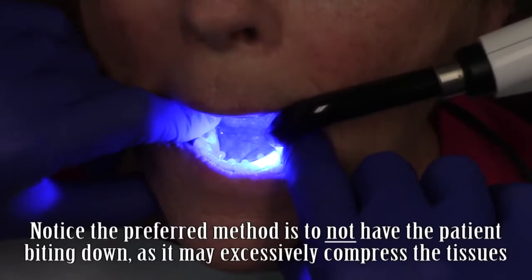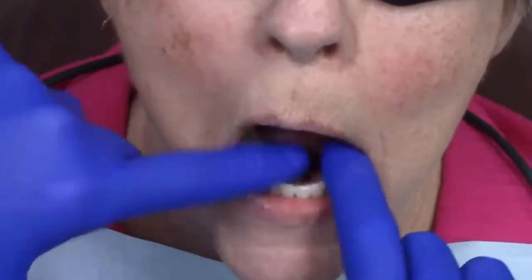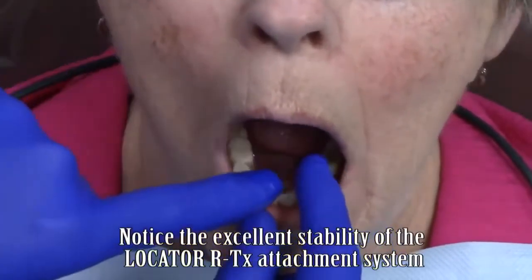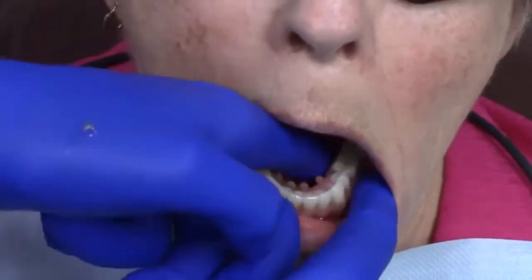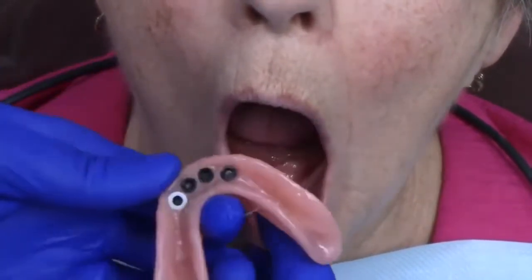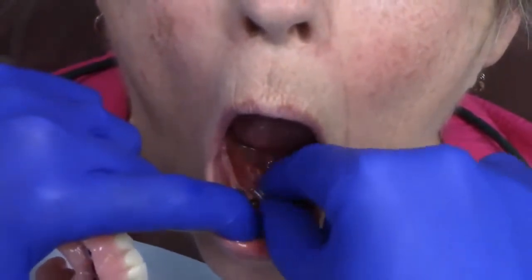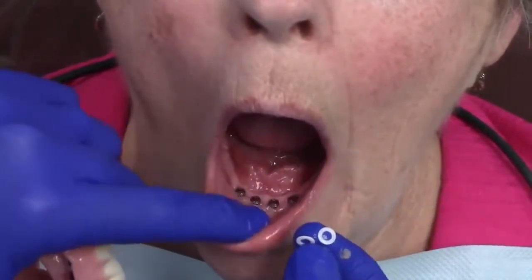I can use a light curing unit to cure the chairside attachment processing material. After approximately 2 minutes, complete polymerization of the attachment processing material is noticed. Notice how firm the denture is to the edentulous ridge and the implants. I instruct the patient that they might feel a lot of pressure during removing the denture. Notice how I carefully remove the denture, ensuring that I'm visualizing if there's any loose material such as blockout spacers inside of the mouth or on the Locator RTX abutments.